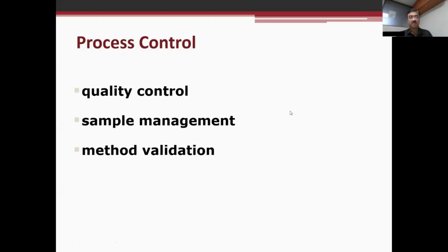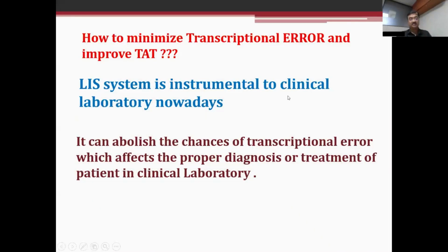It is not an experimental mode. It's a mode where the results you are analyzing will be acted upon. So validation is the most important thing. Method verification: validated methods may come to your lab, but you have to verify whether they hold true for the patients which you are serving. So method verification is also a very important thing in this case.